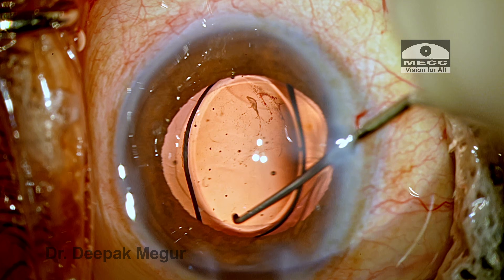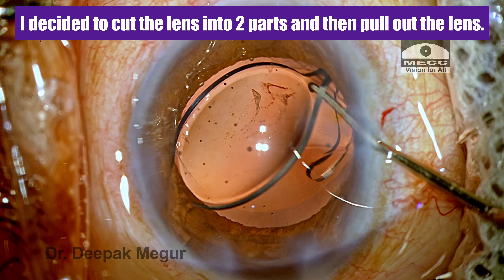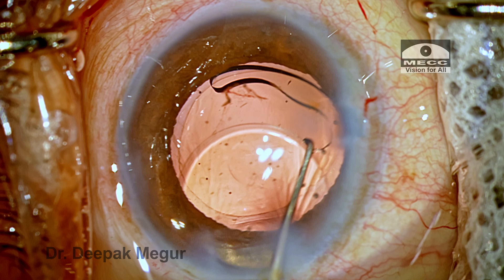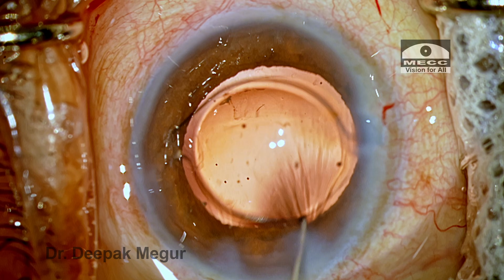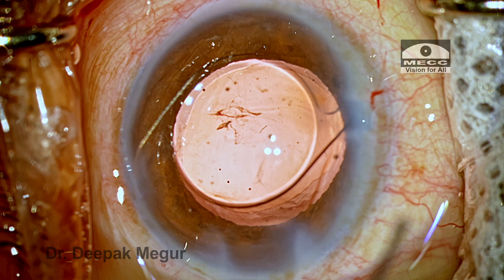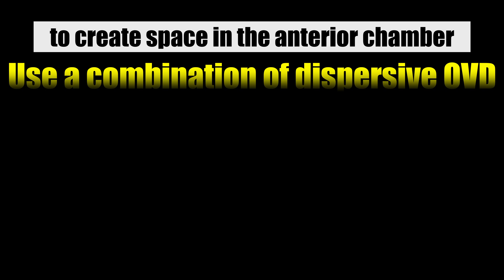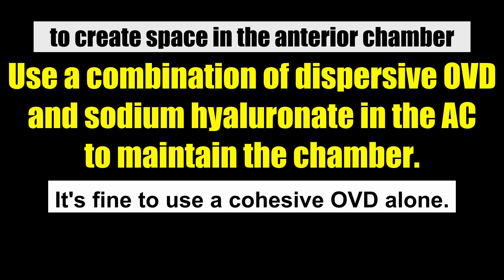The technique I'm going to demonstrate in this case is cutting the lens into two halves using scissors. The lens is maneuvered into the anterior chamber and aligned in position. We want to create space within the chamber and maintain it, so ideally we use a combination of a dispersive OVD on the back of the cornea and sodium hyaluronate or cohesive OVD in the anterior chamber to maintain the chamber well. Using cohesive OVD alone is also fine.